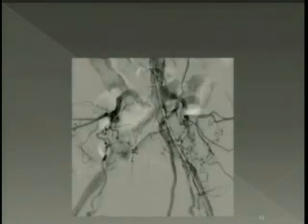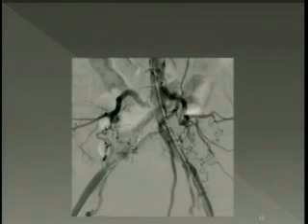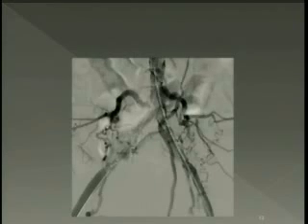But in this case it's not very calcified, it's a smooth artery. For a calcified lesion, maybe I would have crossed by radial or humeral approach, but with a smooth lesion I don't think it's a big problem. With calcification, it's sometimes difficult, yes.